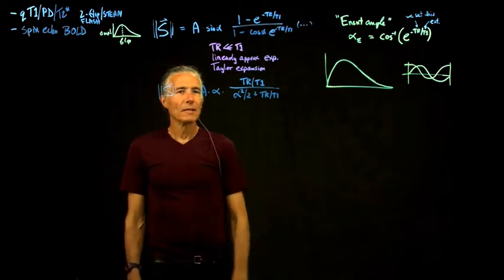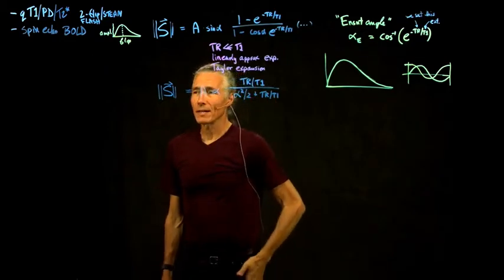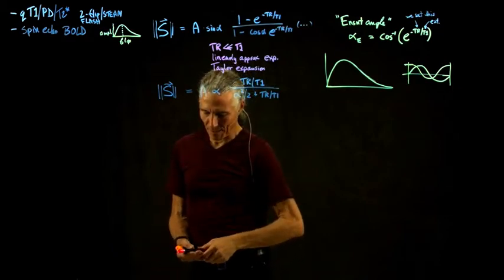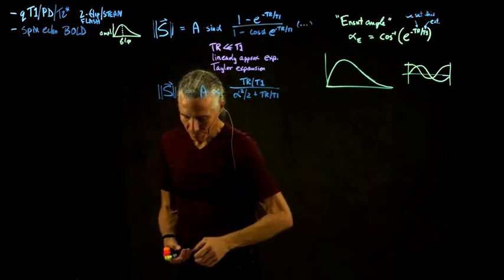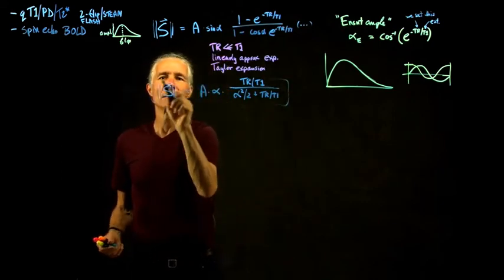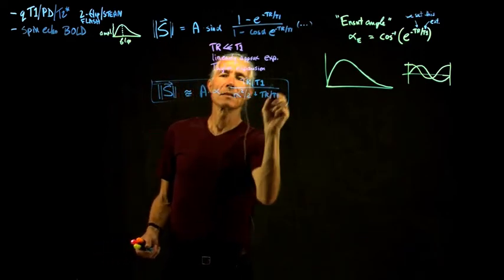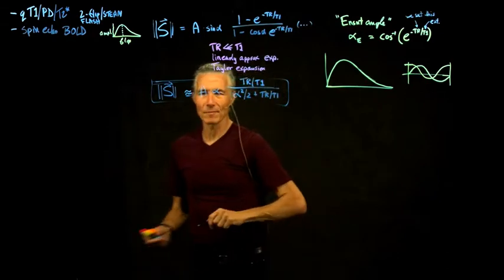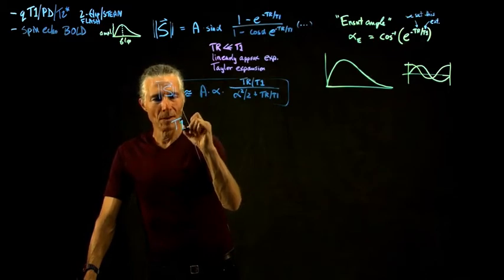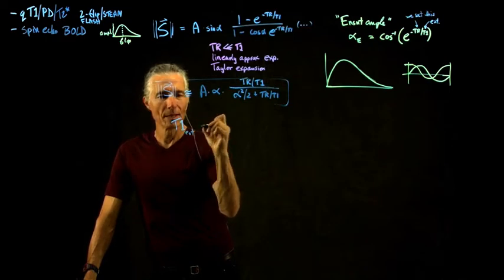So this is virtually the same thing, but the advantage now is that we have a linear equation that we can simultaneously solve a second copy of. This is approximately equal to our approximation. So now we just need 2 copies of it. And if we have 2 copies of it, then we can solve for our T1. So we can just solve this equation for T1.